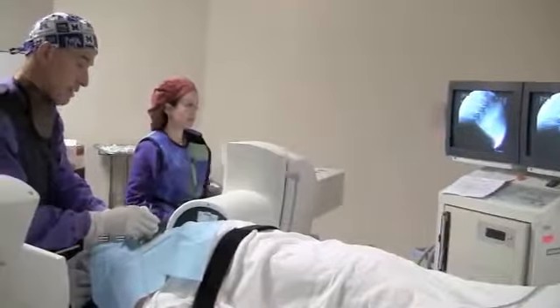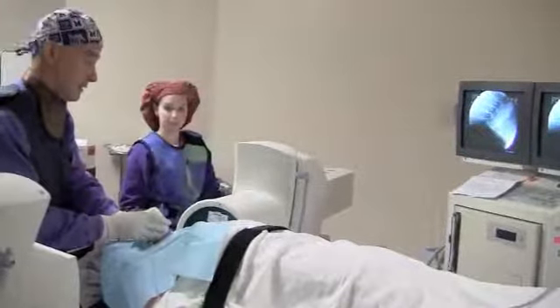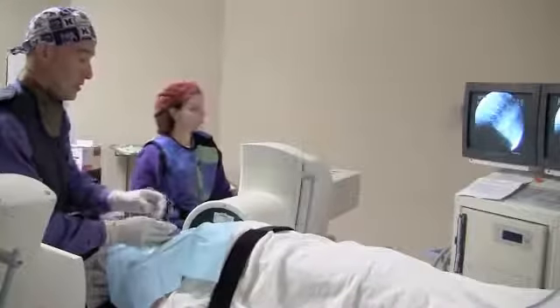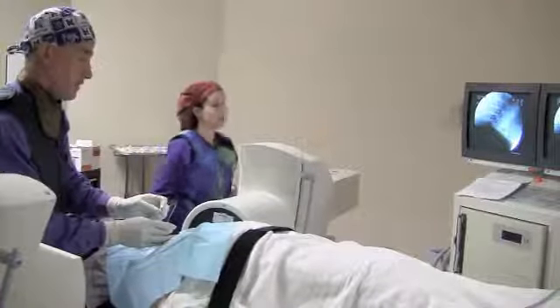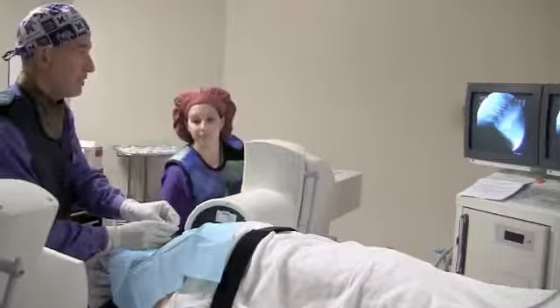This is a C5. We'll shoot that one. So we're going to inject this one there. Ready? Good. Nice. Very nice. You doing all right? Okay, great. Almost done. Hopefully this gives you a good idea of what's involved with a medial branch block in the cervical spine.